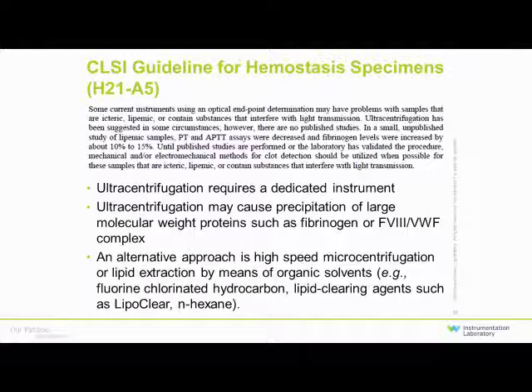So some people use microcentrifugation to do this or other organic solvents that actually clear the lipids. However, the current CLSI recommendation is that until published studies are performed or the laboratory actually validates the procedure, methods that don't have the interference should be used. It's important to be able to detect that at the appropriate level before really proceeding with altering that sample.